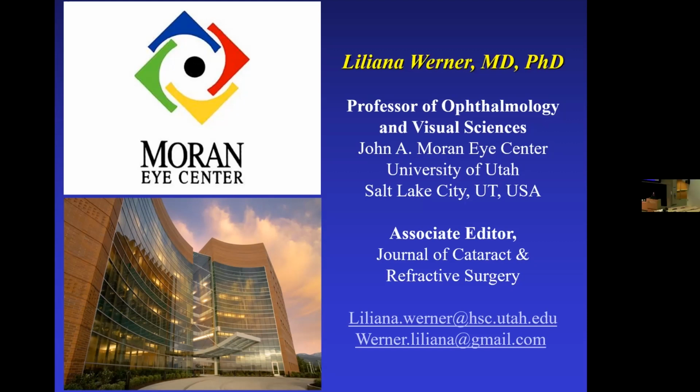It is a great question, because of course you want a material that's very clean. As an ophthalmologist, you want to sit at the slit lamp and see a lens that's beautiful, that is clean, that doesn't have glistening, calcification, anything. But when you talk about the new lenses on the horizon, there are also all those new ideas about accommodating lenses. Those lenses require certain properties. So we have to take into account the biomechanical properties too, because some materials may be more flexible than others. So you have to take into account the entire thing. But in terms of avoiding all these glistenings and calcifications.